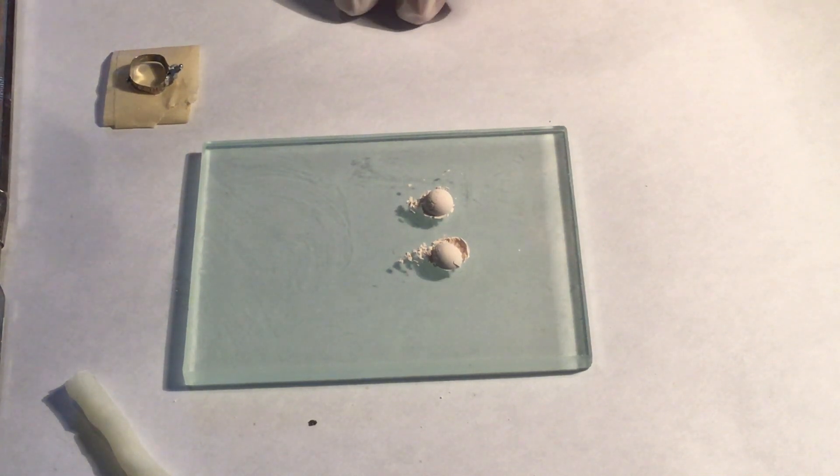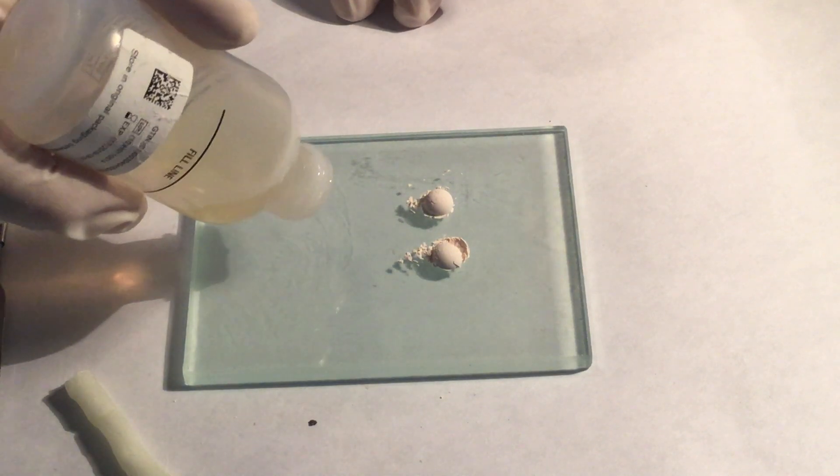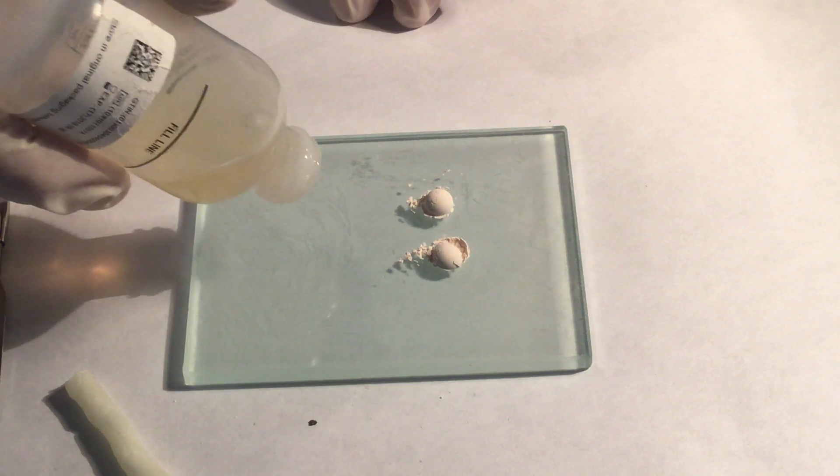Accurately measure the powder and the liquid, and dispense onto either a pad or a glass slab, according to manufacturer's instructions.